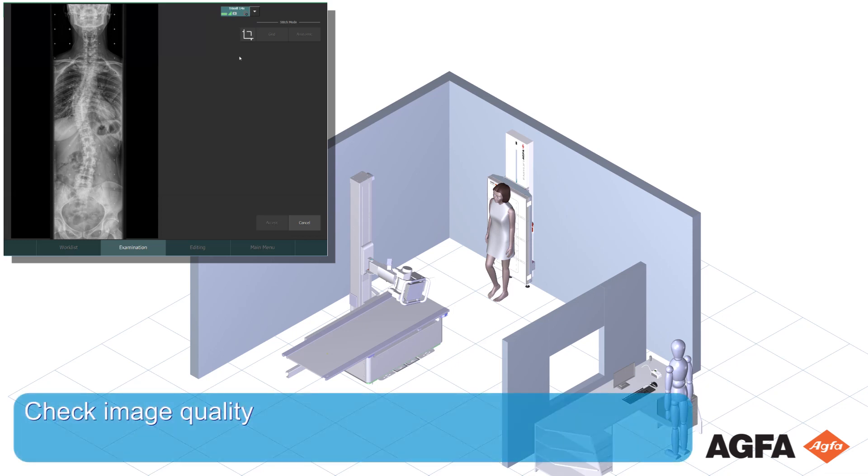Check image quality. If image quality is OK, release the patient. The full leg full spine workflow is finished.